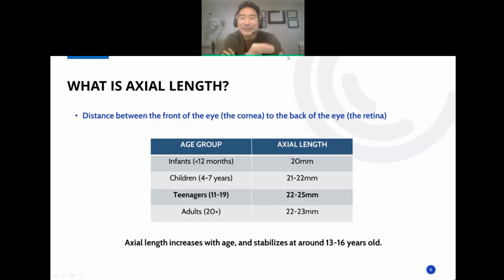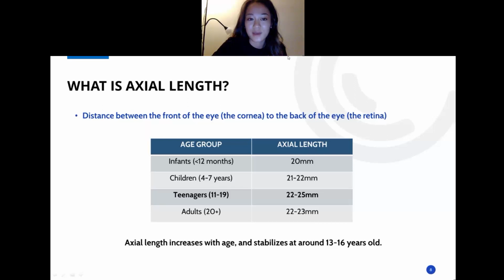We ask each other, hey, what will happen if I did this? Well, this is what's going to happen. Sometimes if he needs more plus, then maybe we'll have to start the specialty lenses. Maybe I have to use +3 at distance. So we have to play around with it, looking at their binocular status, their accommodative status, and versions and all that stuff.